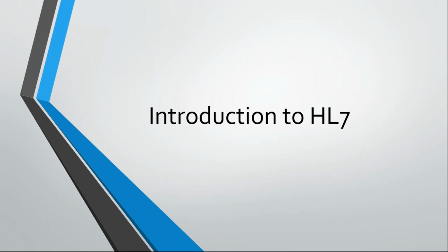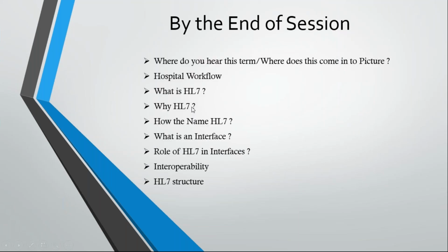In today's session, we are going to take a look at an introduction on HL7. Where do we hear this term? Where does this come into the picture? And we'll take a look at the basics of hospital workflow, which stands as a blueprint for us to see what kind of HL7 message types are generated at which point of time. We'll see why we need HL7 and how the name has been arrived at. And we'll also see what an interface is, how an interface is built, what the role of HL7 in interfaces is, and what interoperability and HL7 message structure are as well.